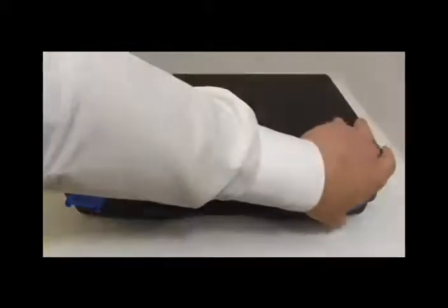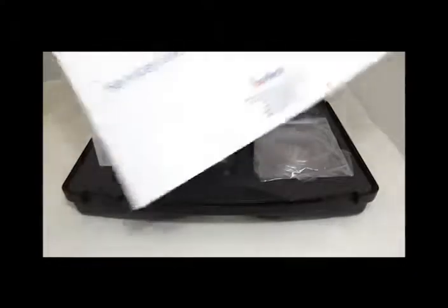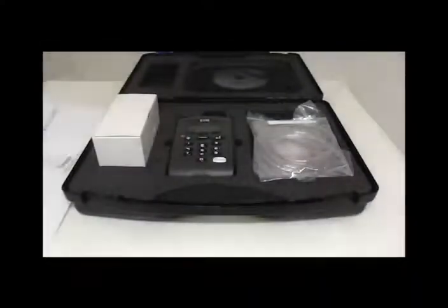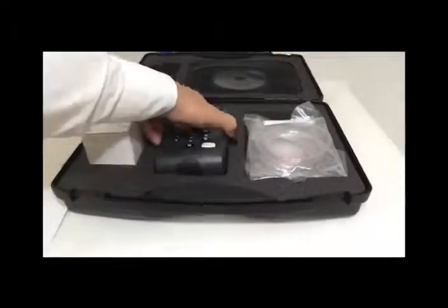Once you've opened the case, you should find a document holding either the calibration certificate or the service report, or maybe both. Depending on which accessories you have purchased, they will be in the surrounding slots. Please ensure they are all there and let us know if any of them are missing.